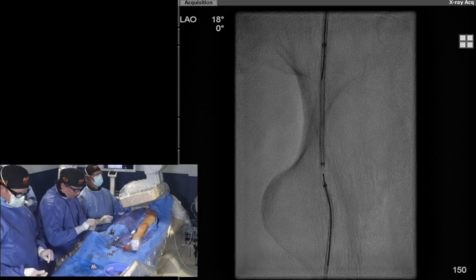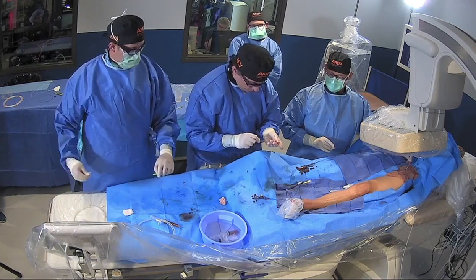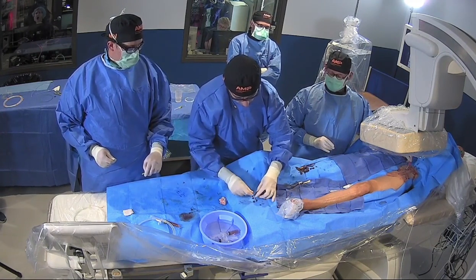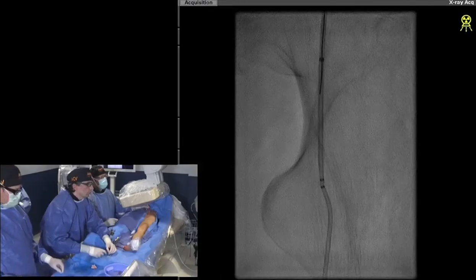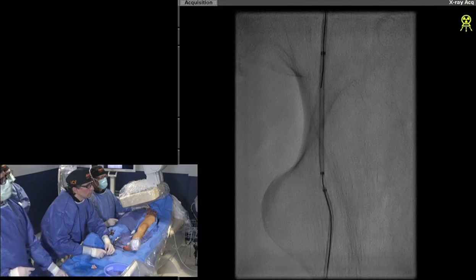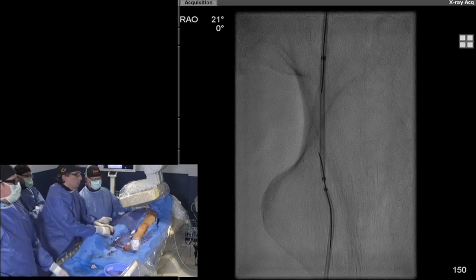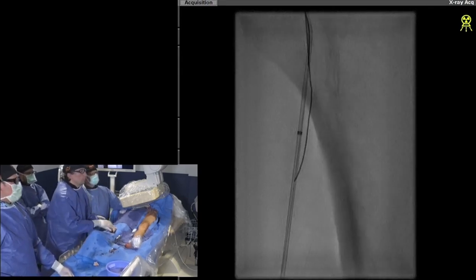I have an 014 Command wire. Which atherectomy would you use based on ultrasound so far? The only atherectomy I would use would be laser in this case because we're in a subintimal plane. Brian: I would echo the same thing — I'd use laser but would want to confirm under intravascular ultrasound for best resolution of plaque morphology and location. Fatty, you may want to just take a balloon down there and feather the two lumens — ultrasound will show us.